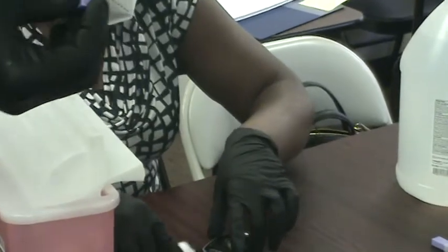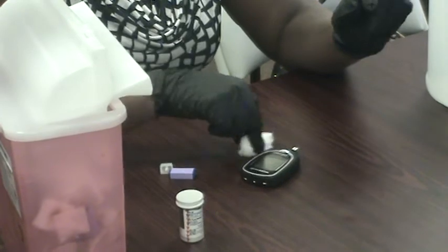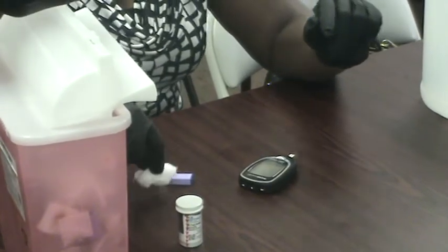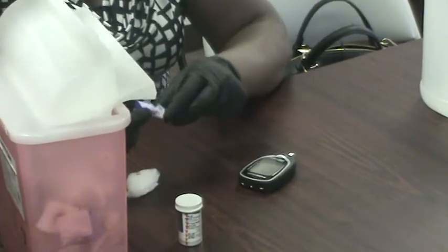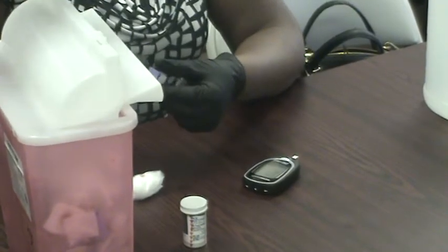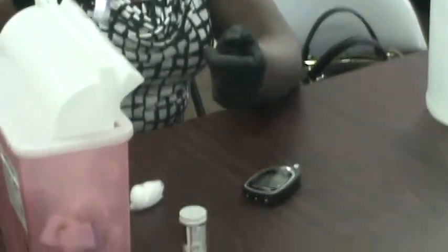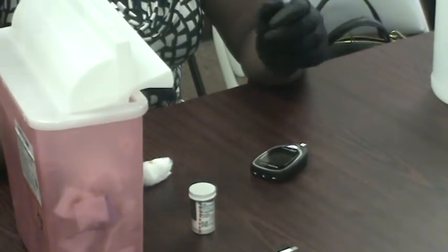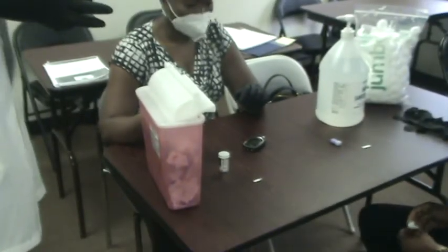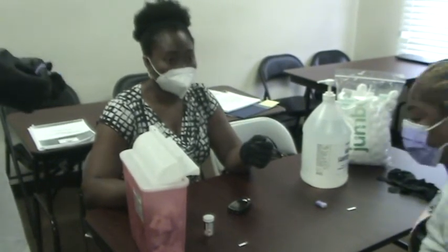So our sugar is 121. Is he high? You're going to get insulin injection. Really? No, just kidding. But according to the order, you will not get anything. She's supposed to get it from 130, but everybody's different. Sometimes the doctor will say from 120. It depends on the individual. Because for some people, 130, they don't need to get anything, whereas other people, 120, they need to get insulin. So it depends on the individual.